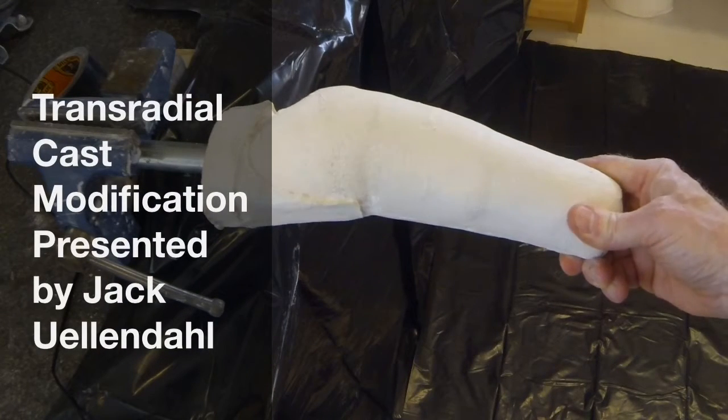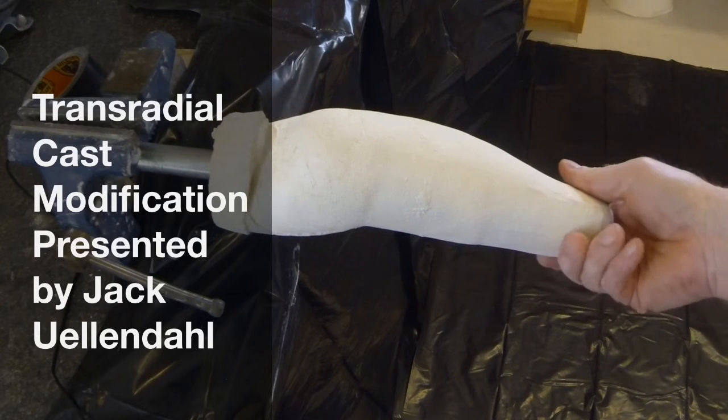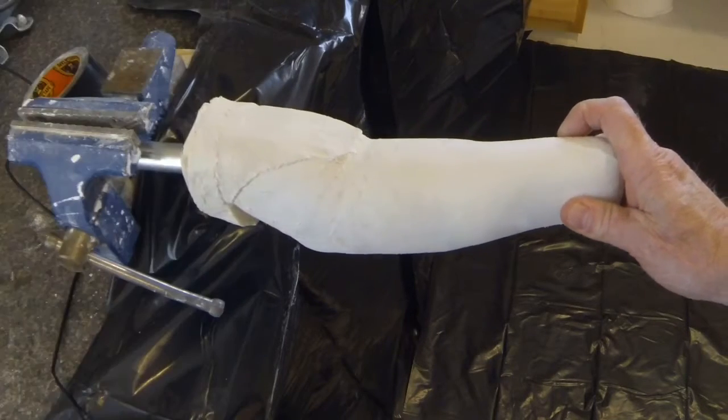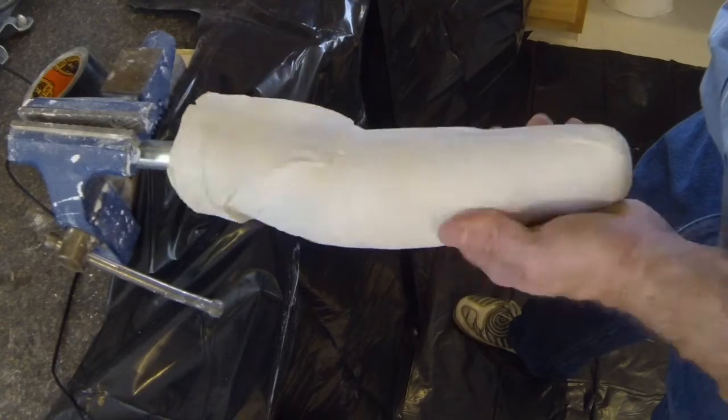This video will show cast modification of a supracondylar transradial socket. The cast modification demonstrated is specifically for use with custom rolled silicone socket construction. Modification variations for use with thermoplastic sockets will also be highlighted.